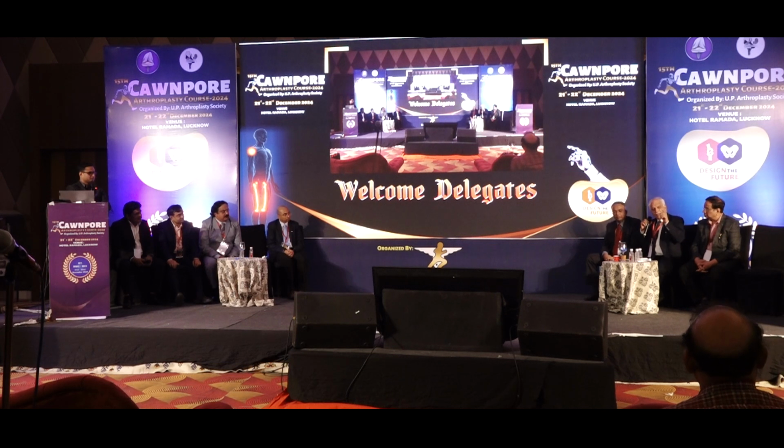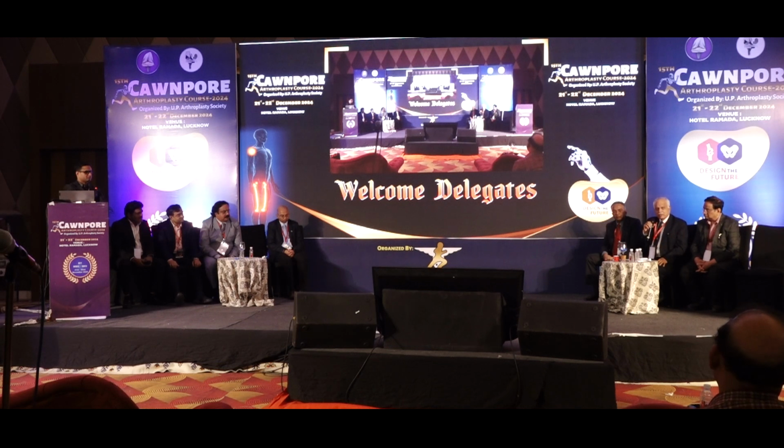And sometimes the flexion deformity may actually be because you overstuffed the joint. Instead of an 8 spacer, you have put a 10 spacer. And you miss that, you have left some 5-10 degree flexion deformity on the table. That cannot be corrected by any manipulation. You will cause a fracture. So that's why I asked whether it was your case. If somebody has done a case and left a flexion deformity on the table, not even God can correct it later, because it is created on the table by overstuffing. Understand? But 3 months is too long.